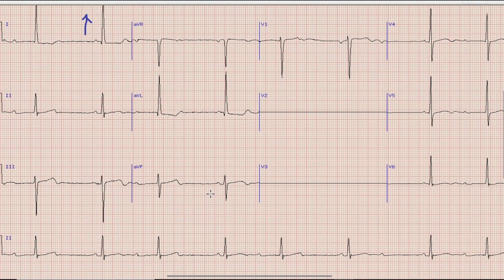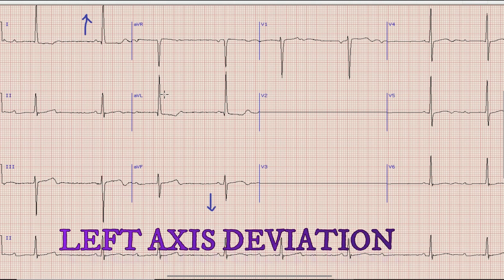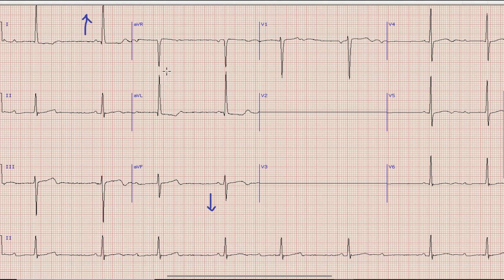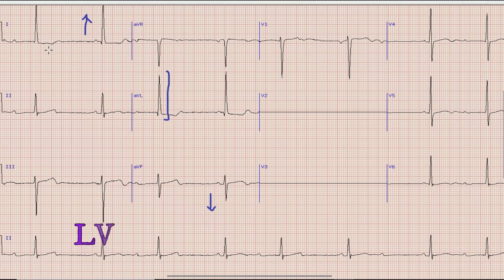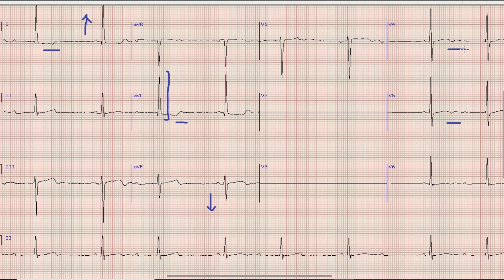Next is axis. The QRS direction is upwards in lead I and downwards in lead aVF, so the axis is left axis deviation. Concentrating on lead aVL, the R wave is quite prominent — approximately 20 small squares in amplitude. As per Sokolow criteria, an aVL R wave more than 11 small squares indicates left ventricular hypertrophy. There are also T wave inversions in leads I, aVL, V4, and V5. In this setting with left axis deviation and LVH, these T wave inversions are most likely due to left ventricular hypertrophy.